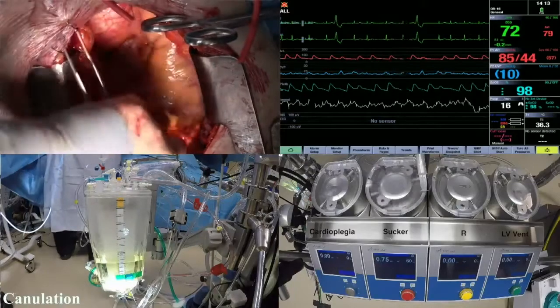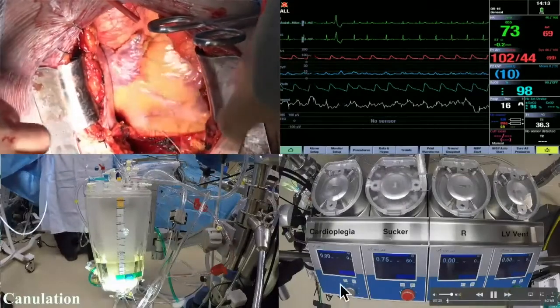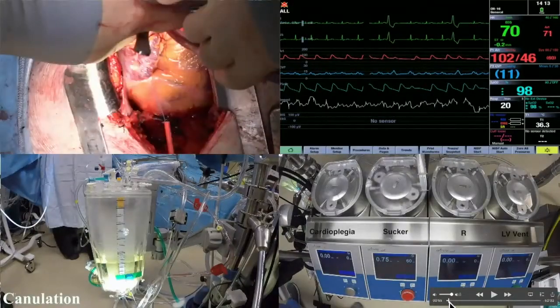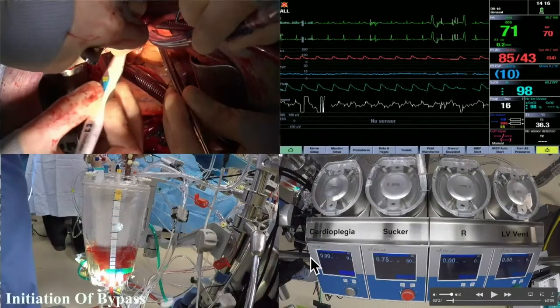And then to the right is the heart-lung machine with the various pumps spinning. So can you fast forward that a little bit and just go ahead and get to the going on bypass phase? Which was that, Patrick? You might have the number. Yeah, that one is 3:25. Yep, 3 minutes and 25 seconds. So we'll fast forward on this a little bit.